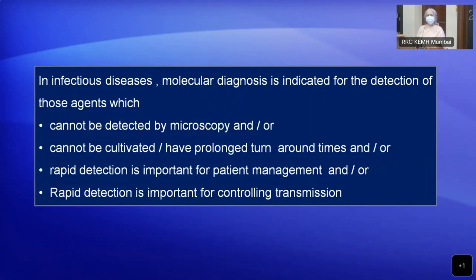So infectious diseases, what is its role? Do I have to do it for every single organism? For example, you have heard of staphylococcus, cholera, typhoid. Is it necessary to do it for everything? Is it necessary to do it on all samples? Probably not. So this introduction of mine before going into the clinical laboratory practice is going to be a little longer than usual introductions. It is mainly done for organisms that cannot be seen by microscope.